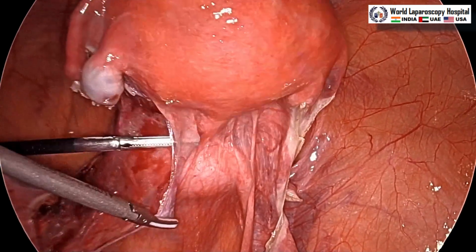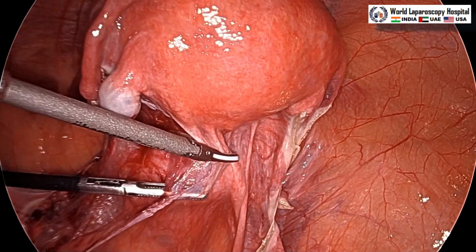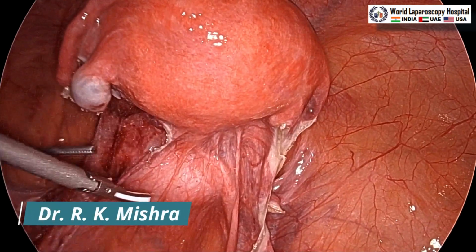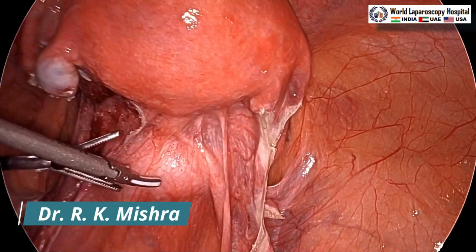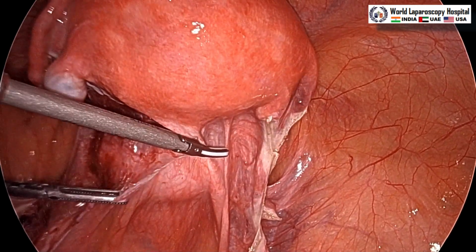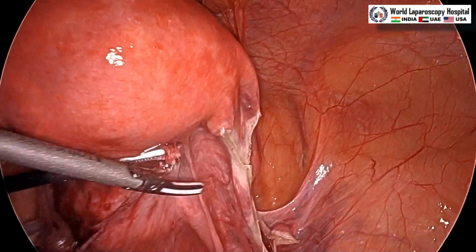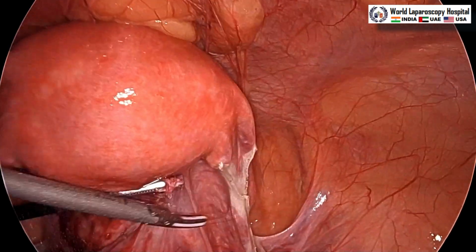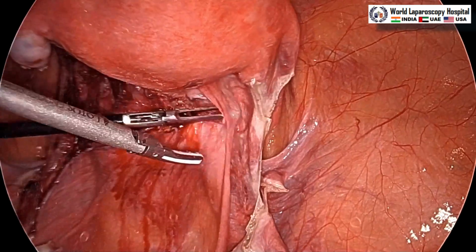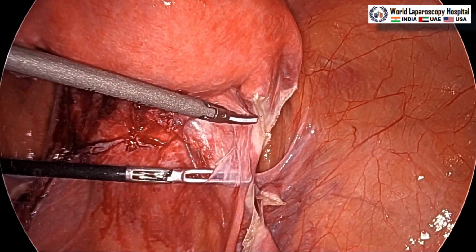You have to be careful that when you are separating the posterior peritoneum, the harmonic tip should give inferomedial traction and the tip of the harmonic should not touch the uterine artery or vein, otherwise a very dirty bleeding will start because it will puncture it. So, slowly from left side to right side, the posterior peritoneum is getting opened and now the uterus is at 11 o'clock position, and then we will continue similarly to the right side.